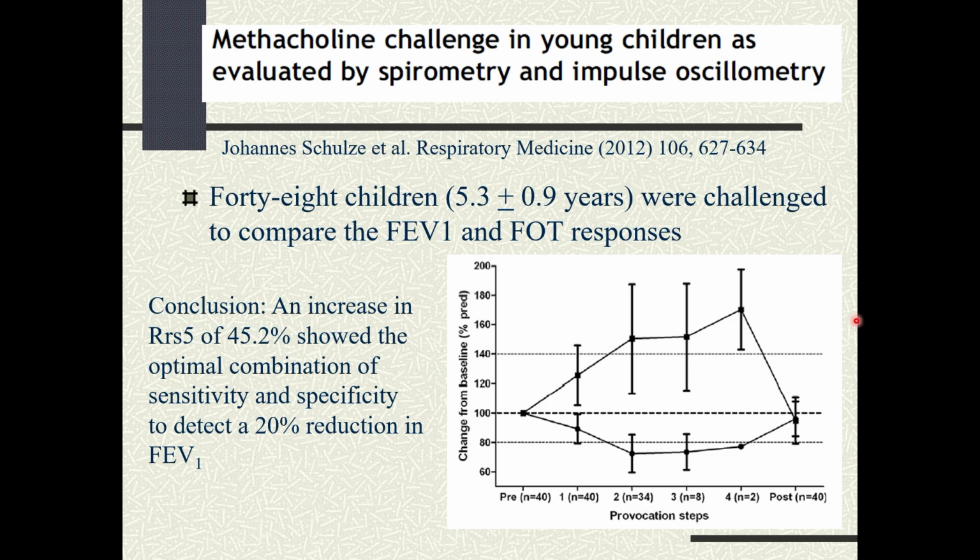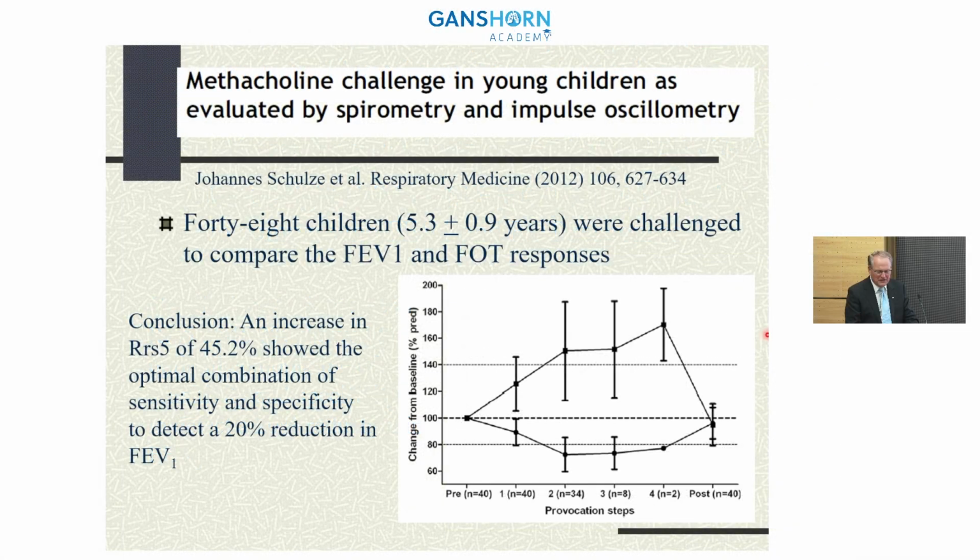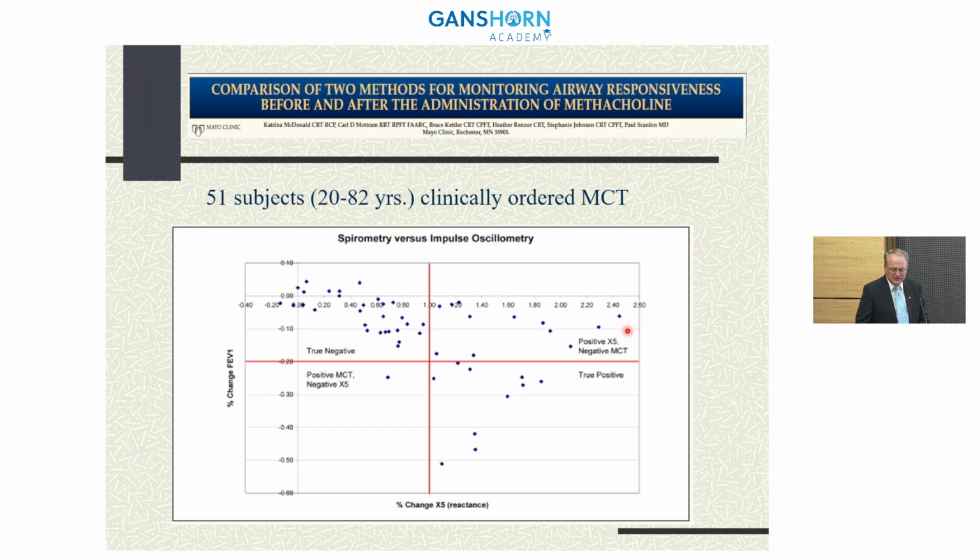And in this paper that was published in Respiratory Medicine in 2012, looking at the response to a methacholine challenge and the response that would be required from an FEV1 perspective and the response that would be required from a resistance perspective. So making the comparisons in individuals that could perform spirometry.